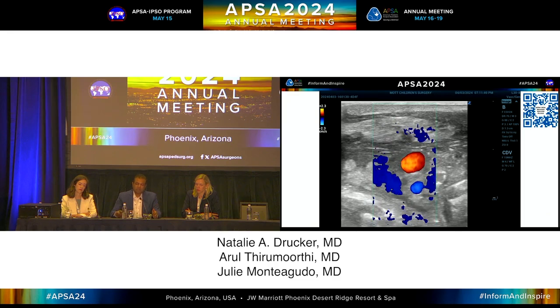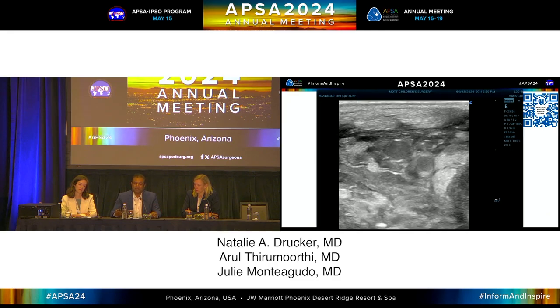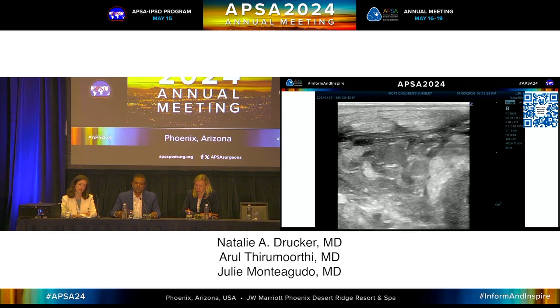I took a lot of these images because I want to have no doubts of where I am and what I'm getting the needle into. That's actually probably the best picture there.